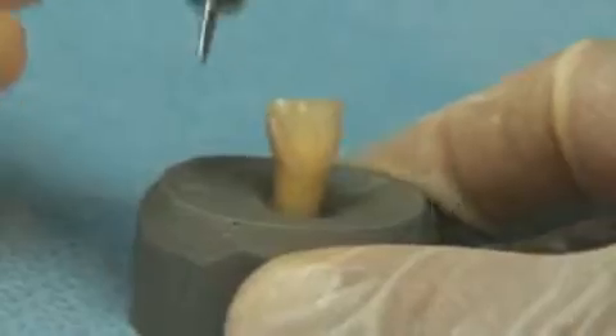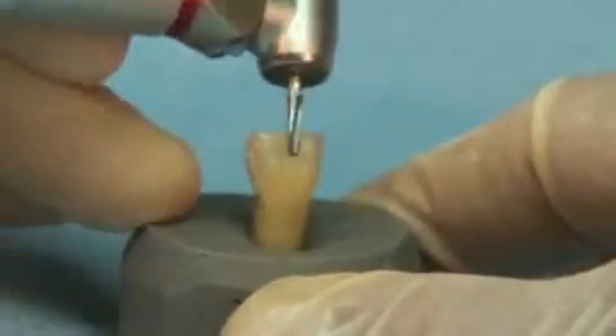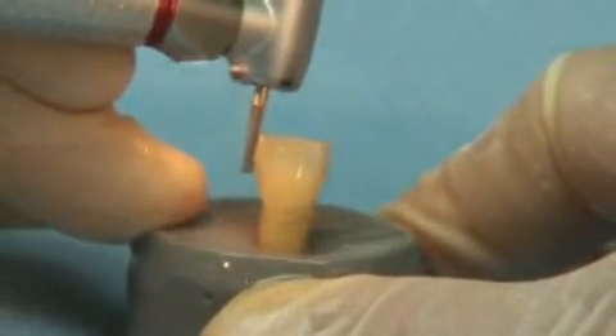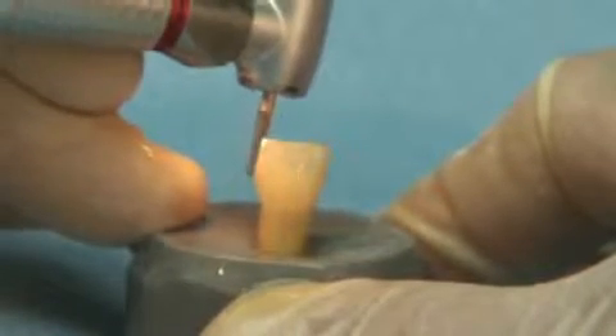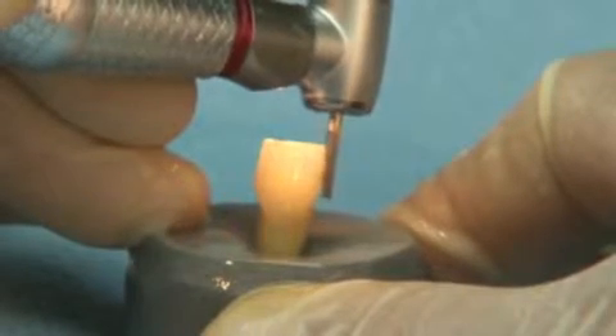The 847 series offers 8 millimeters of cutting surface, making it ideal for both anterior and posterior crown preparations. Ultra's extra thick neck design eliminates breakage concerns, making this bur the ultimate crown preparation instrument.